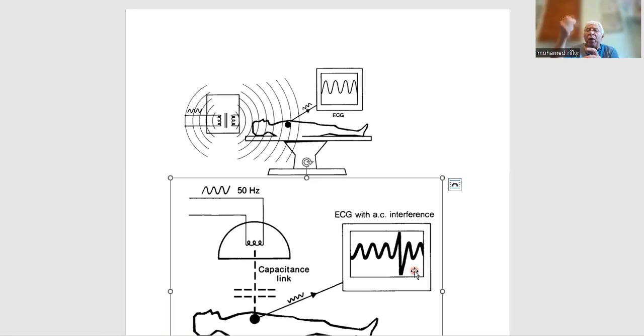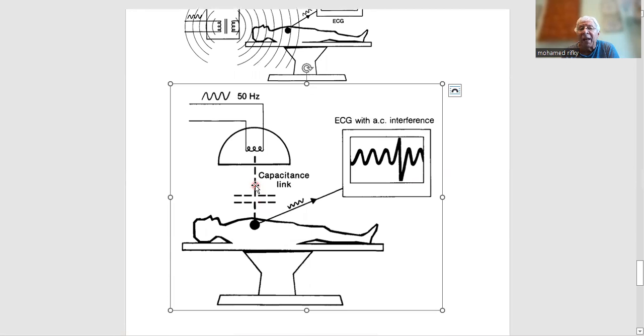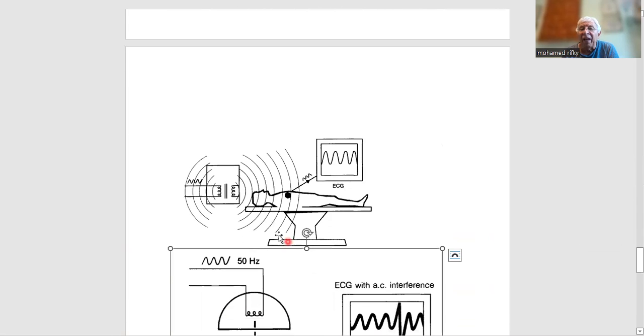So whenever we have an interference current, it will go through this woven metal to the earth and will leave the normal ECG tracing not attenuated and well traced on the screen. So this is a way, what we call screening. So this is a capacitor where it can interfere, and also an inductor of MR or whatever can interfere with the ECG tracing.